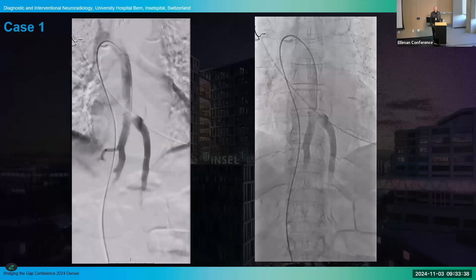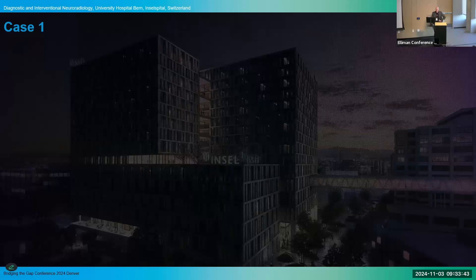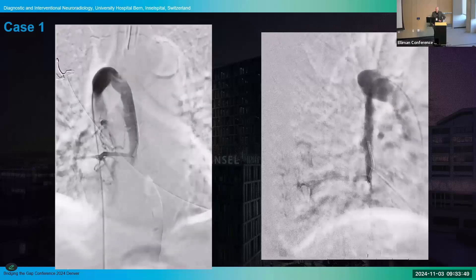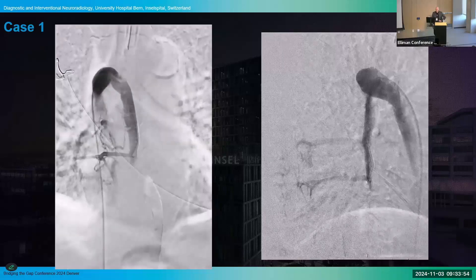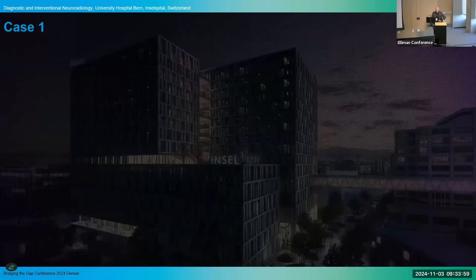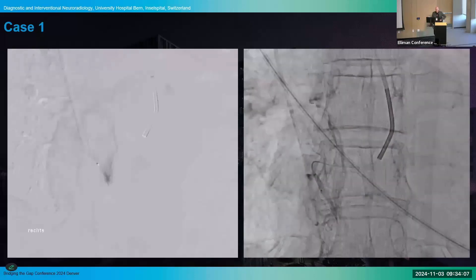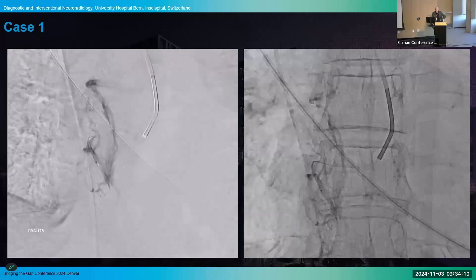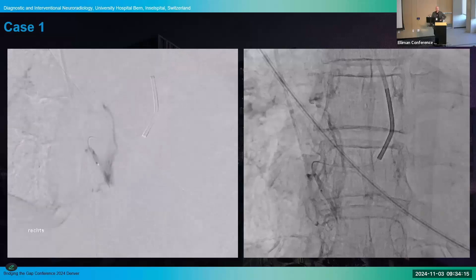You count upwards from T12 to T8 and think, okay, somewhere there it must be. You look for where the vein is, do another run — and there it is. You see all the veins inside the neuroforamen, you see the epidural plexus — this is just a lateral view. You see this is your target, that's where you want to go. Then you advance your microcatheter or whatever materials you're familiar with and perform the embolization. Another run confirms you're perfectly in the right position, because some of those veins are the venous part of the CSF venous fistula, and this is what you want to occlude.